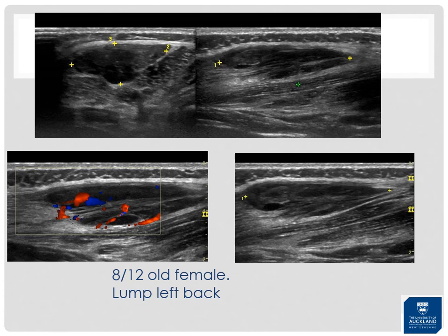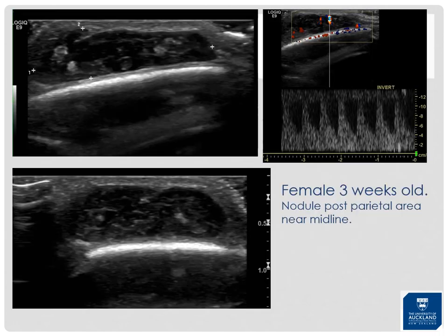An intramuscular mass — not in the dermis, not in the subcutaneous tissue, but below the fascia — that is well-defined but with poorly-defined posterior margins and quite vascular, could range from a sarcoma to a benign vascular malformation. Such cases definitely need MRI. A separate case: a 3-week-old female with a well-defined compressible 20mm heterogeneous hypoechoic mass in the post-parietal area, moderately vascular with arterial feeders and venous flow.